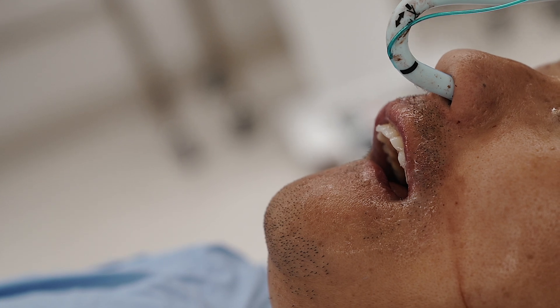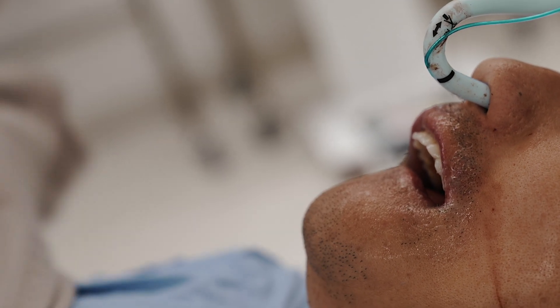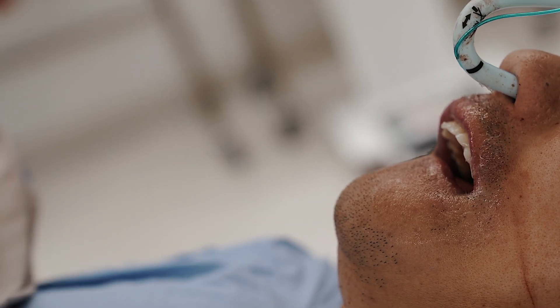The main benefits of this surgery, as seen in the video, are the relatively short surgical time, the fact that the patient receives their set of teeth immediately upon waking, and also that the surgery negates the need for any other procedures, including augmentation or sinus lift procedures.